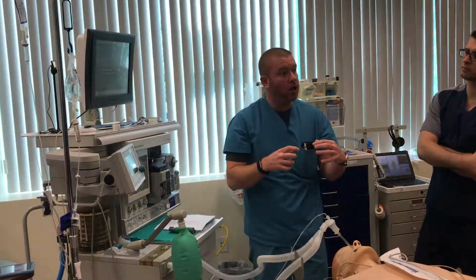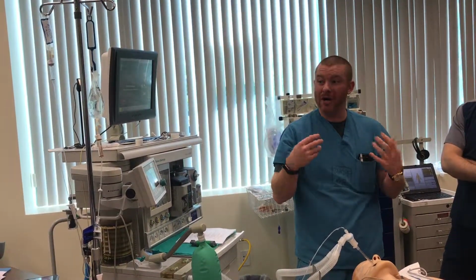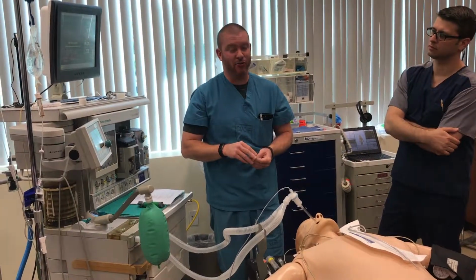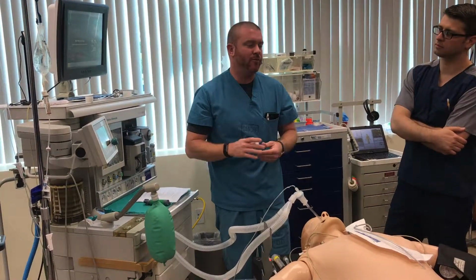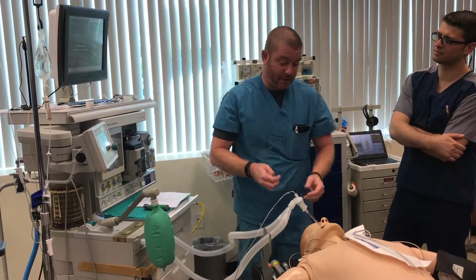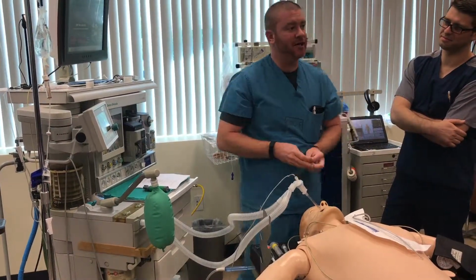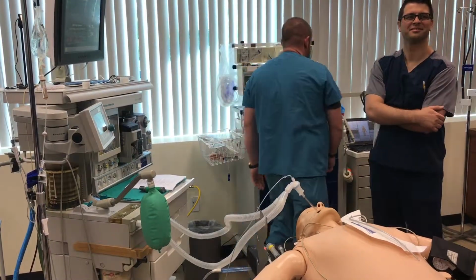Or you can put them in a headlock, and when they cry, it's a great thing because they're taking bigger breaths of this gas, and about 3 or 4 breaths, they'll go right to sleep. So they're not going to even remember the headlock. Trust me. So now you know how to do a mask induction. Great. All right.